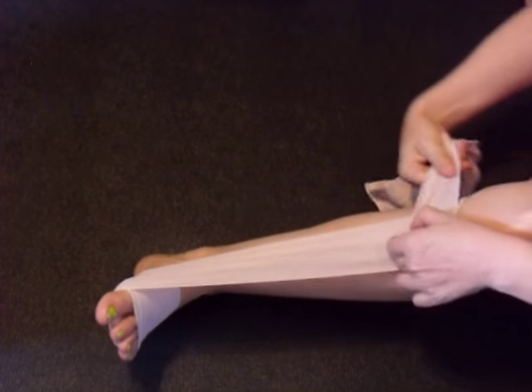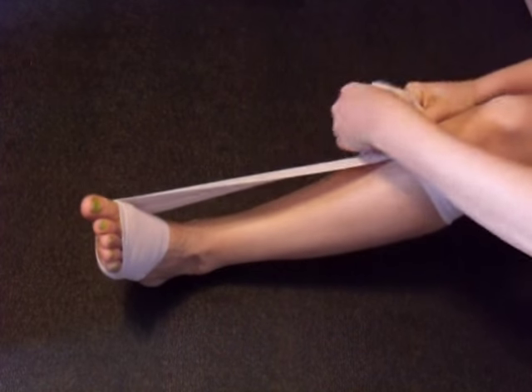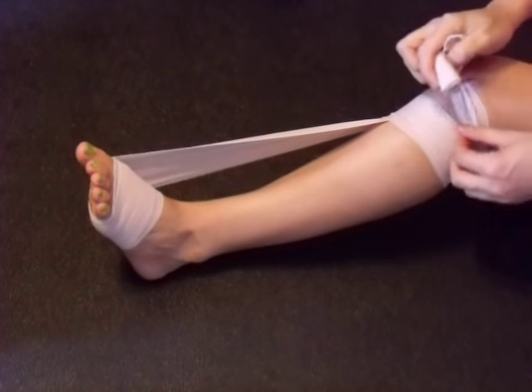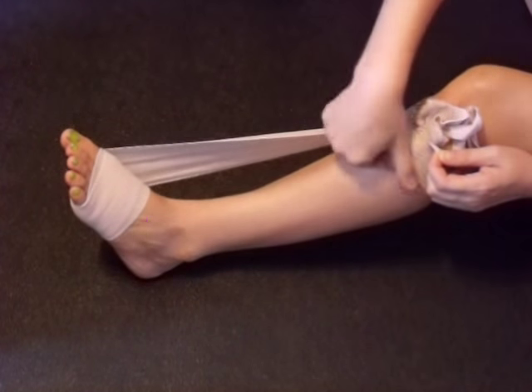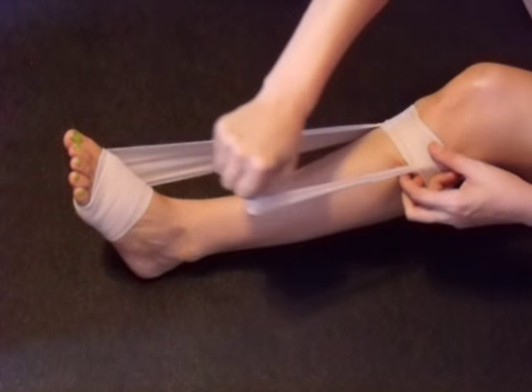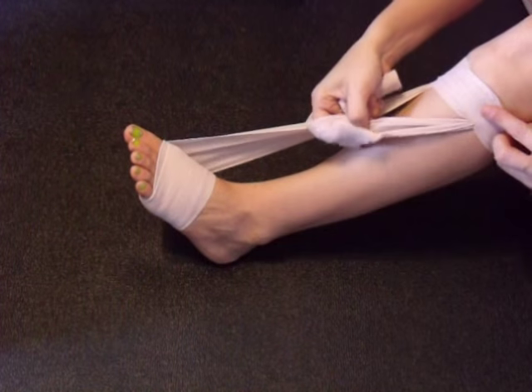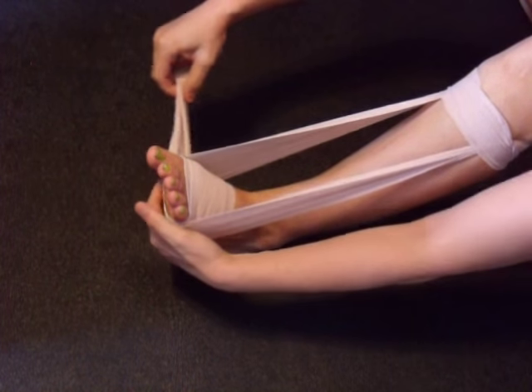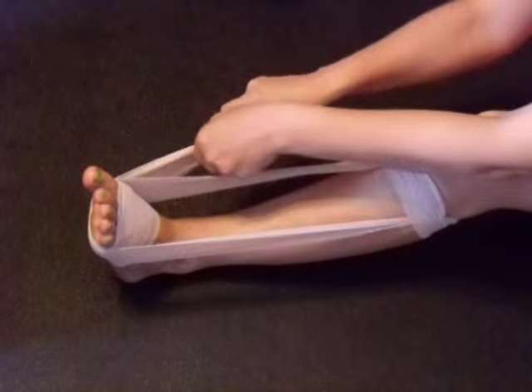I used to get sprained ankles a whole lot when I was a kid, and this was a way I devised to be able to take care of myself and my ankle. Now I went up and under this, and then come back here — and that's basically what's going to form your brace.